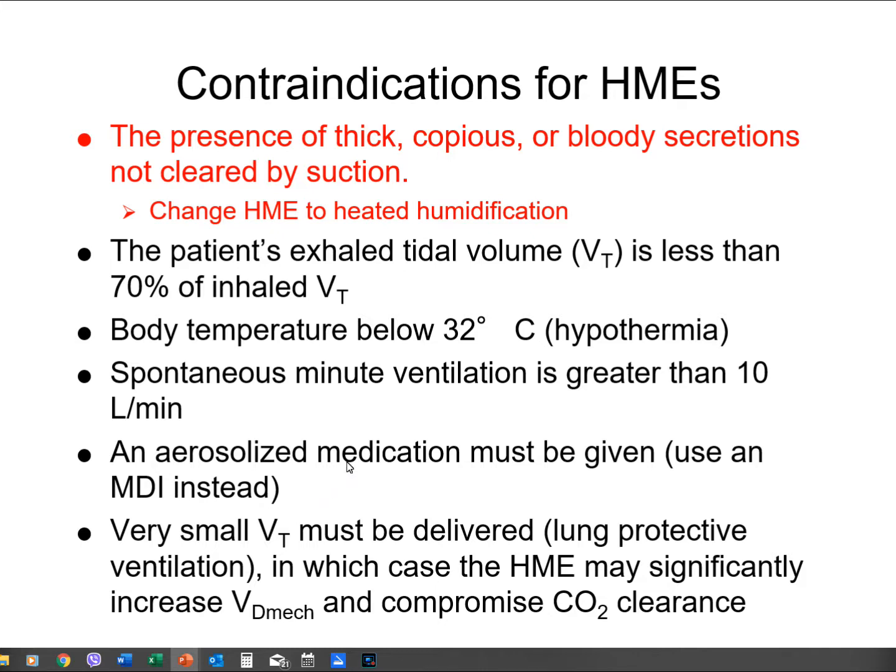We had this discussion in lab. Some students have asked me, do you keep the HME on when you run a breathing treatment? Now, I'm going to tell you this. It depends on the facility. And I'll tell you this also. Sometimes the facility does not have policies on HMEs, and if you're to remove them during nebulization of any medication. But I'll tell you this. The manufacturer states you need to remove the HME before you give a treatment.